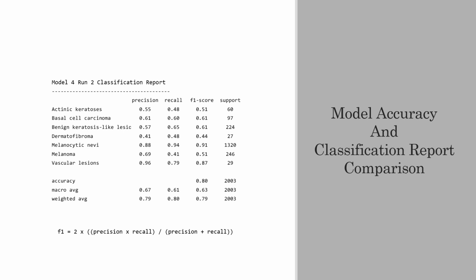However, the problem is that accuracy is not a particularly good indicator of how well a model performs when the data is highly imbalanced and when there is a focus on a specific class in the minority. So, for the classification report, we will be looking at the melanoma F1 and the importance of exploiting the macro average.